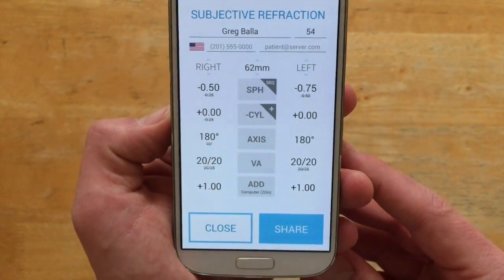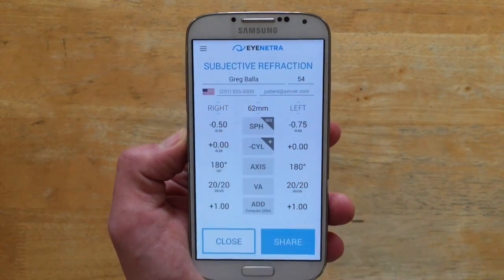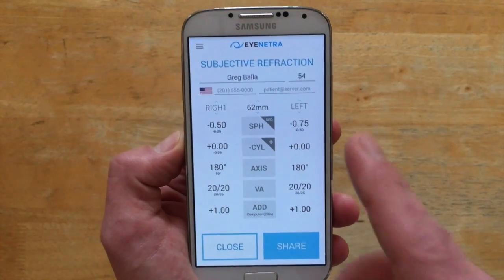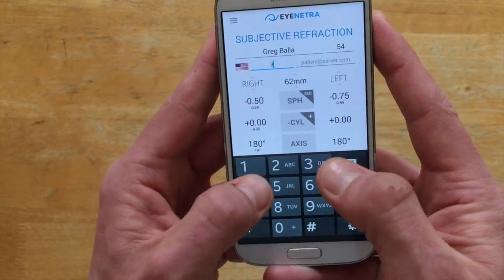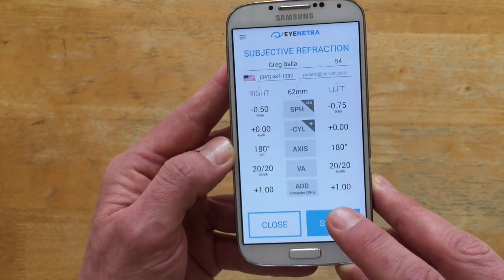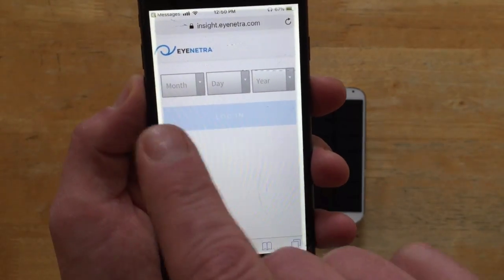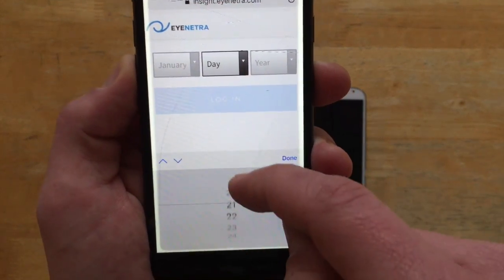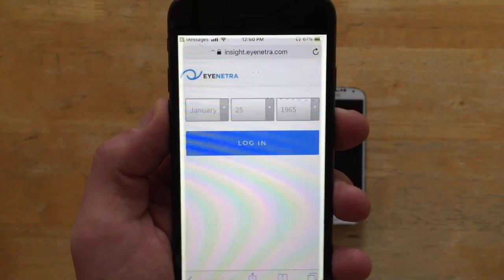Once we're satisfied with the final prescription, we can send it to the patient. We can enter the patient's phone number to send an SMS text message, or send via email by entering the patient's email address. Let's enter the phone number first and click Share to send via SMS. The SMS pops up — we click the link to view the vision testing results. Here we're asked to verify the birth date: January 25th, 1965. Enter the birth date and click Login.